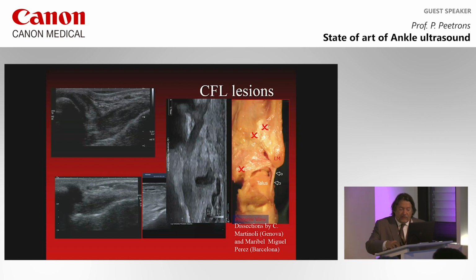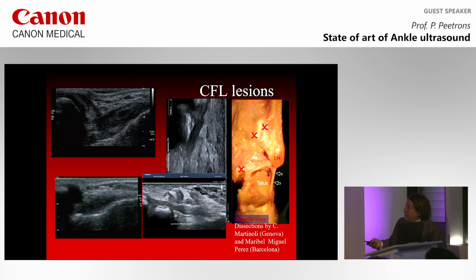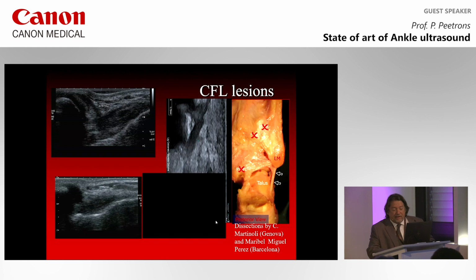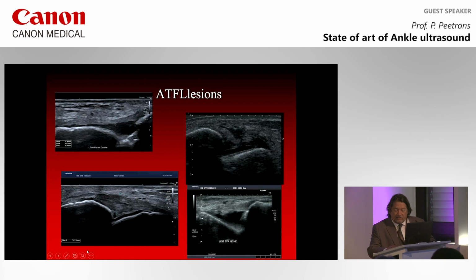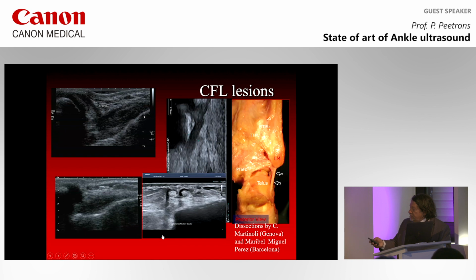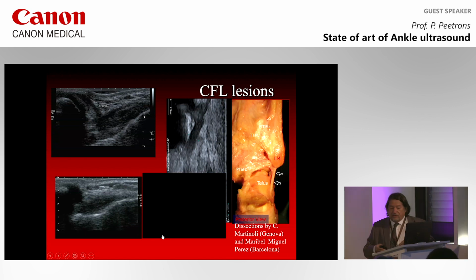And when you're looking at the calcaneofibular ligament, when you stress the ankle, you can see very clearly that the peroneal tendons are pushed up by the ligament and by the tension of the ligament. As you will see again, the ligament is pushing the peroneal tendons up towards the probe, and this is a tense ligament from the calcaneus to the fibula.